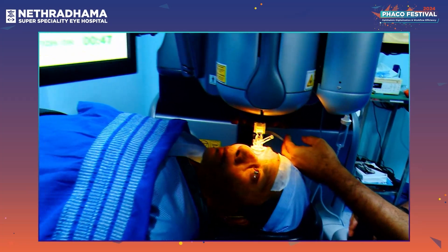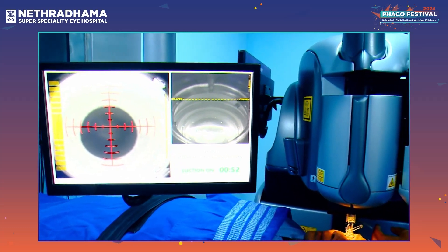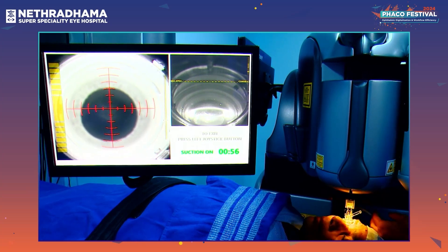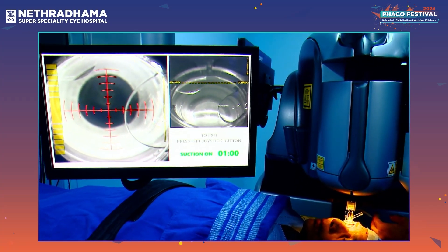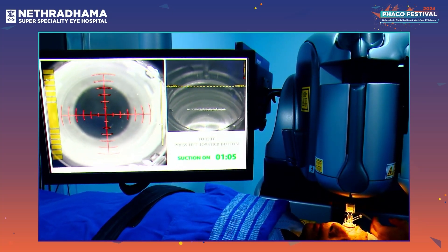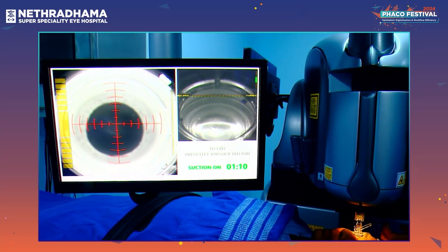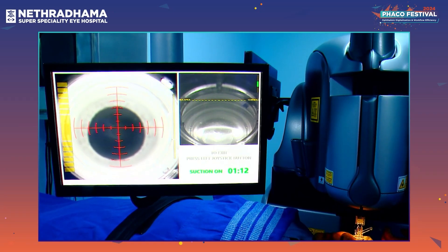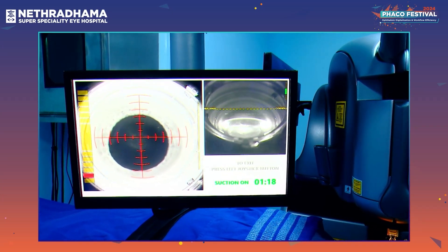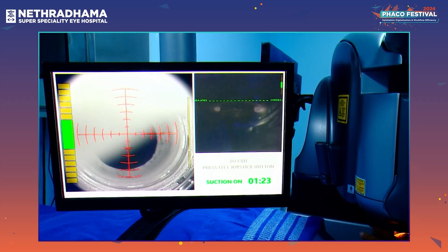This is what the screen looks like when you are doing the docking. The docking is now complete. When this line turns green, we know that we can start the laser.